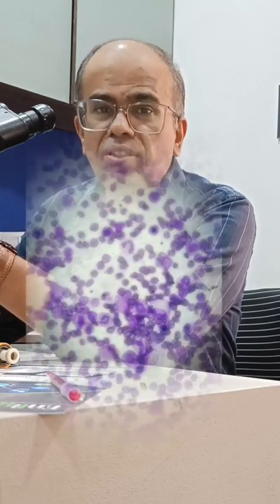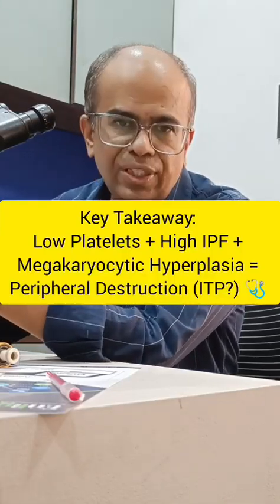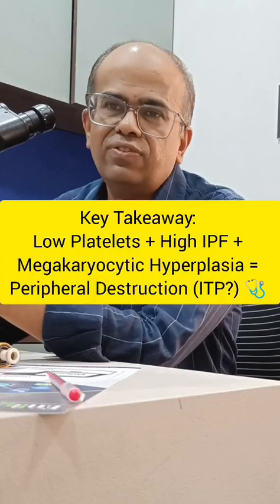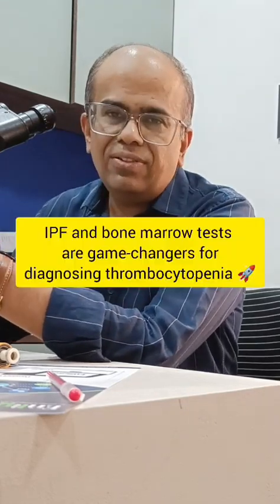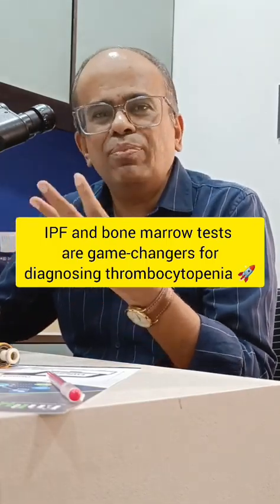Megakaryocytes are going into overdrive, trying to produce more and more platelets, trying to compensate for the peripheral destruction by some mechanism, most likely an immune mechanism in this particular case. So in a nutshell, this case presented with severe thrombocytopenia, high immature platelet fraction and megakaryocytic hyperplasia on the bone marrow. All these are classic features of immune thrombocytopenic purpura in the absence of other causes. So to end, I would like to say that there are two investigations which are game changers in the diagnosis of thrombocytopenia. One is the immature platelet fraction and second is the bone marrow examination.